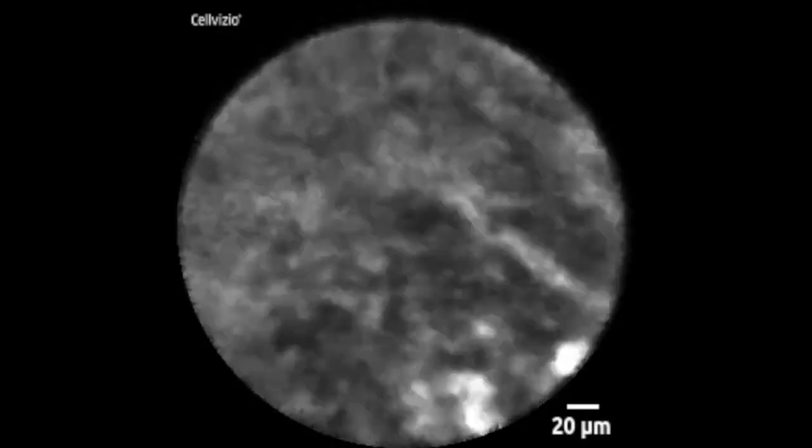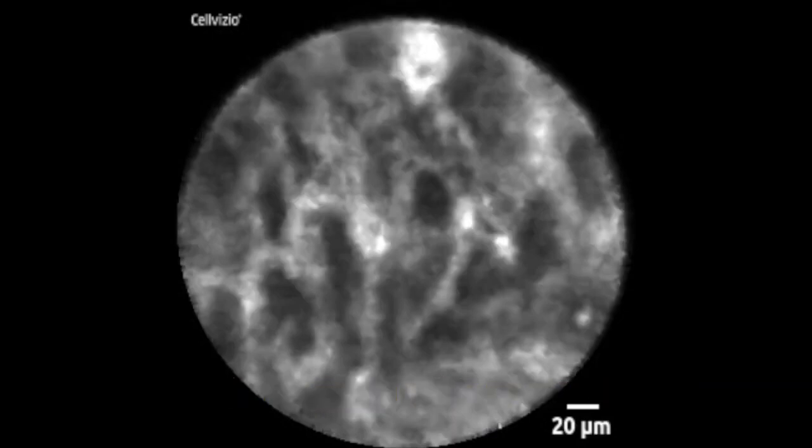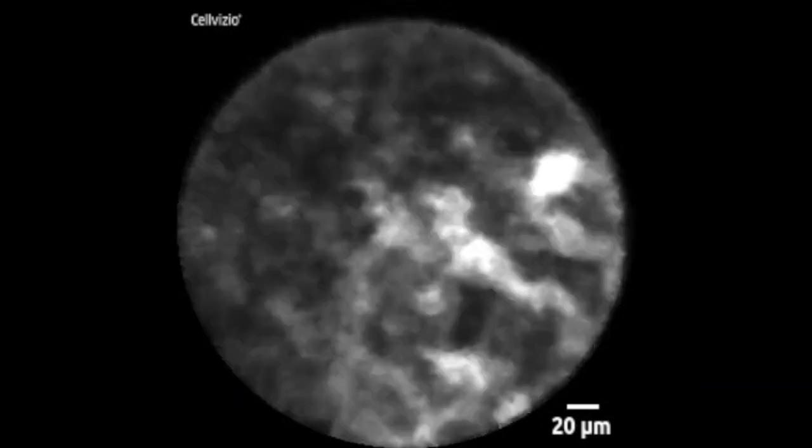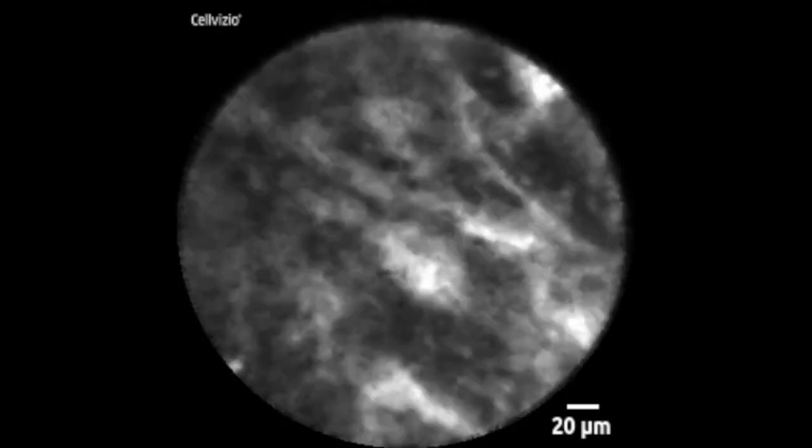But it's important to note that the spaces between these groups and cords of cells are not filled with RBCs, meaning that those are not blood vessels. This is just the stroma separating these groups and cords of cells.